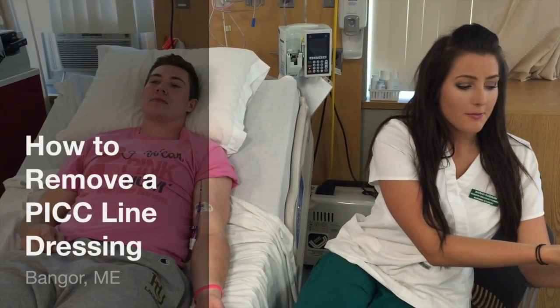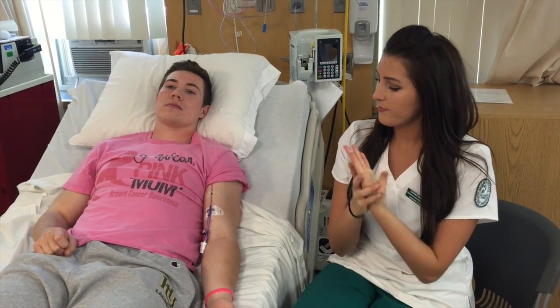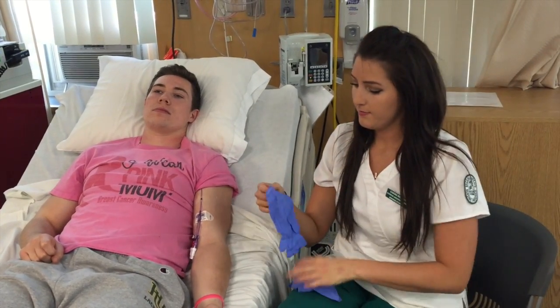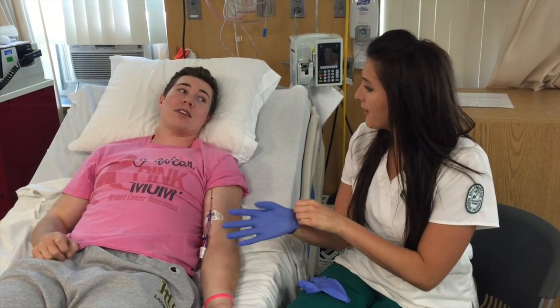So now I'm going to wash my hands, which is a very important step. I'm going to wait for this to dry. Then I'm going to put on some clean gloves. How are you doing, Mr. Martin? Okay? I'm doing well.